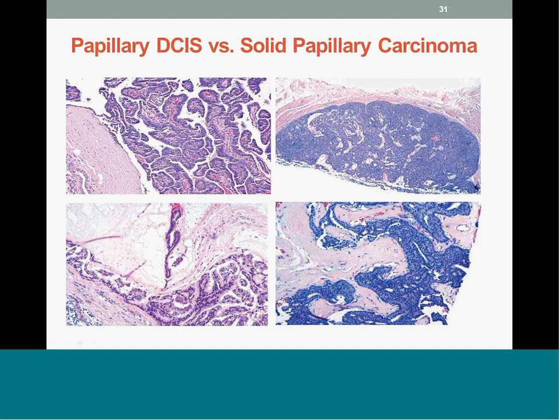Similarly, these are examples of solid papillary carcinoma, and this type in particular can mimic invasive carcinoma, especially on a core. These are challenging on excisions, let alone on cores, and certainly pushing margins can be seen with invasive carcinomas, and the challenge in recognizing this can be quite difficult. So if you sense that there is a fibrovascular band in it, or some element of papillary core in it, these are the kinds of lesions perhaps best to call as papillary lesion, and you might give a differential or suggestion, but recommend that they come out.